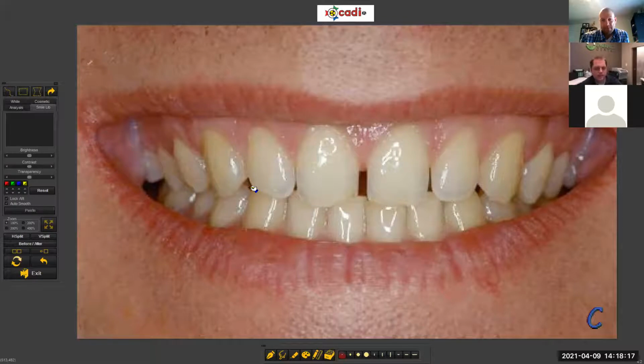I think I'd like to see it. I do a lot of, I don't know if you're familiar with Spear. I know you mentioned LVI, and of course other ones. When you design these things, a lot goes into it, more than aesthetically doing EFSB. I don't know if that's something you're familiar with, but this wouldn't replace that by any means. But as a way of getting a patient excited, to say, what if my mouth looked differently, and you see their whole picture with a different smile, I think there's some value to that.